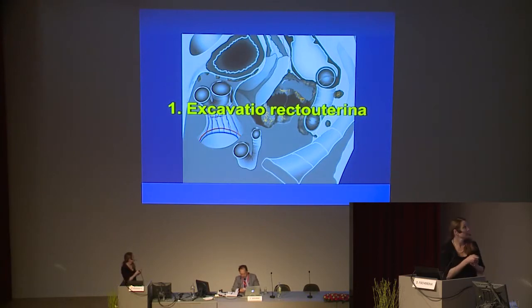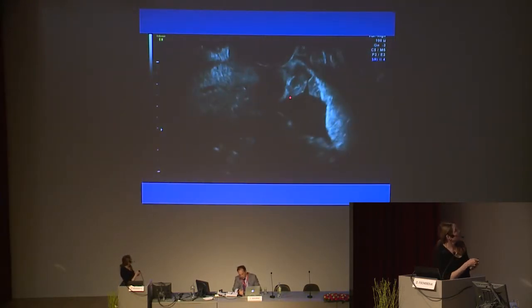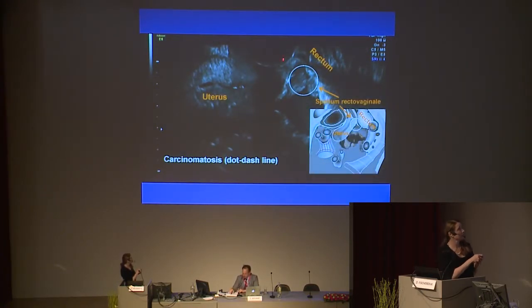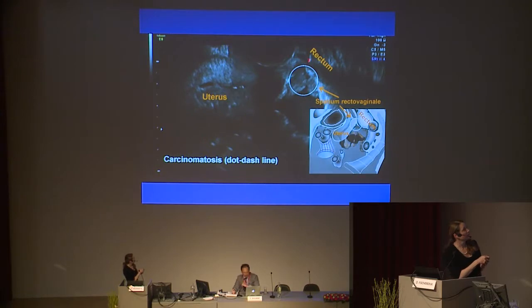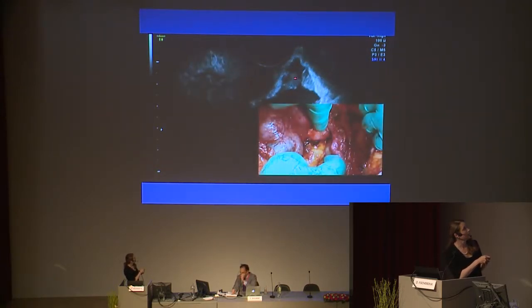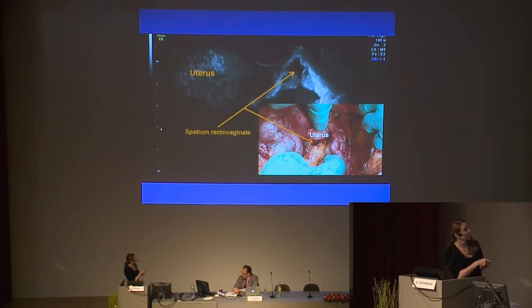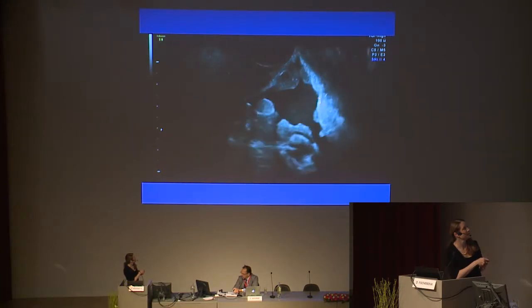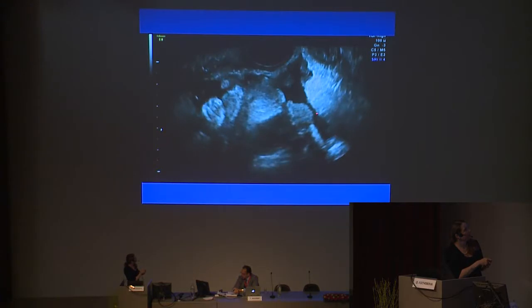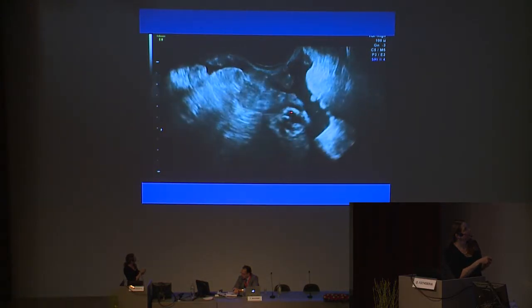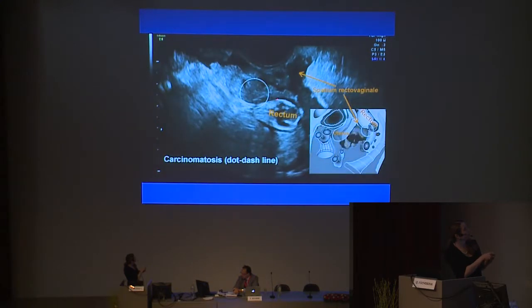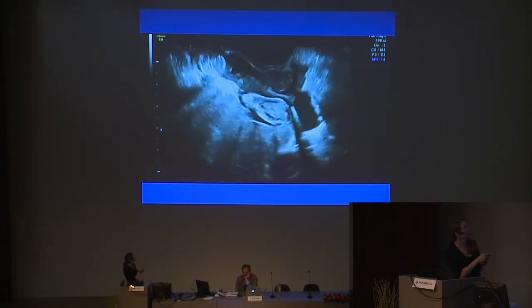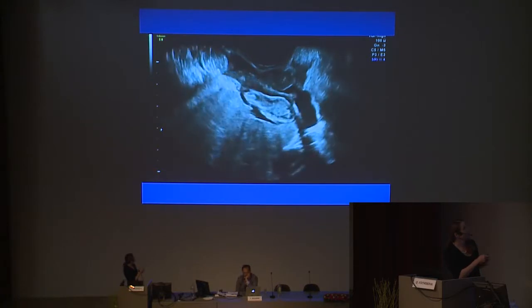This video shows carcinomatosis on ultrasound. The uterus posterior wall — the probe is inserted in the vagina — and in the pouch of Douglas there are hypoechoic nodules in the parietal peritoneum. The intraoperative view shows the posterior wall of the uterus fixed to the rectum and infiltrated epiploics. The Douglas is completely obliterated, and carcinomatosis spreads further on the rectum and sigmoid colon. The hypoechoic muscle layer of the sigmoid colon already disappears, so rectosigmoid resection will be needed because the infiltration is deep, coming into the muscle layer.